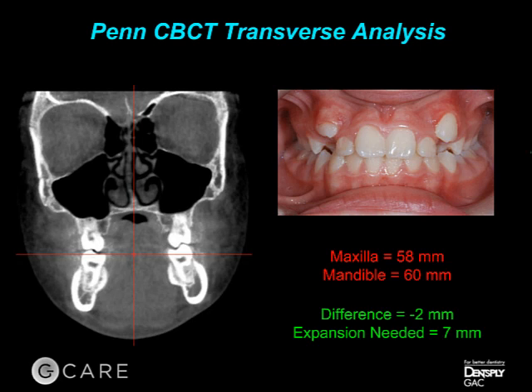Now, there are a lot of people that would say that, oh, that's not needed. Well, if you take a look at our reference position of the mucogingival junction, look at the inclination of those lower molars, camouflaging the fact that the upper jaw is way too narrow for the lower. So this is something that you can all see clinically.